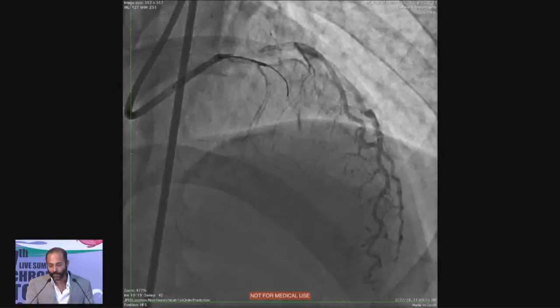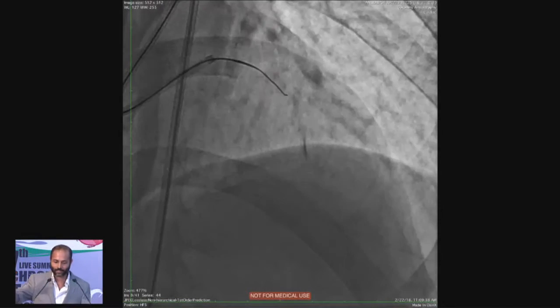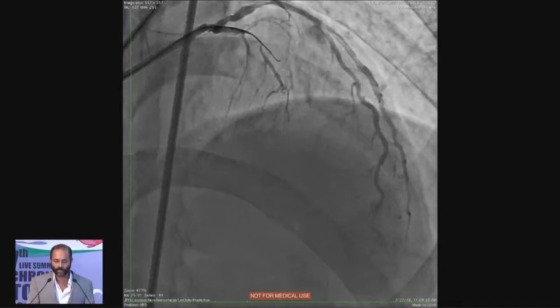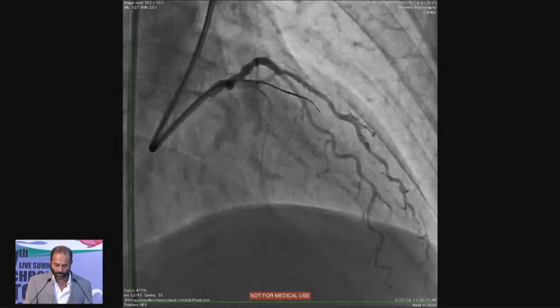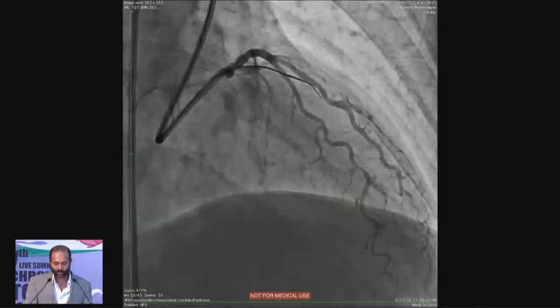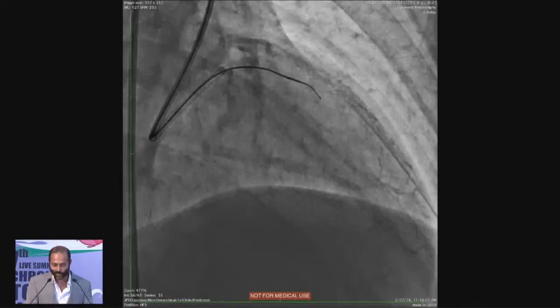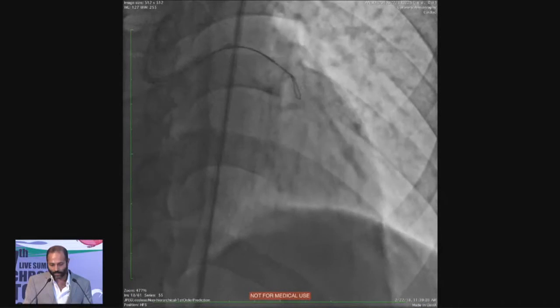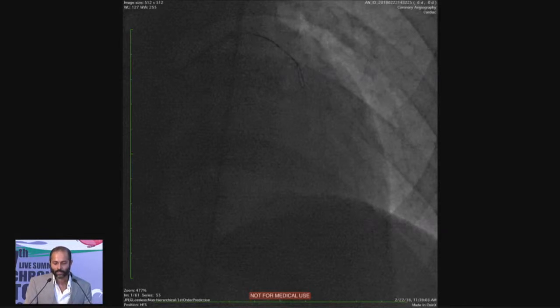Plan was antegrade wire escalation, so an IVUS-guided puncture was done successfully, and you guys have just heard a great talk on it. However, unable to wire the true lumen, and by that time, with whatever manipulation, there was no visualization of the distal vessel. And so really, in fact, Mars was like, let's just stop. I don't think this is going to work. But they were like, all right, we've got to try.